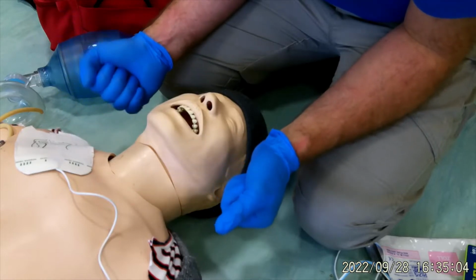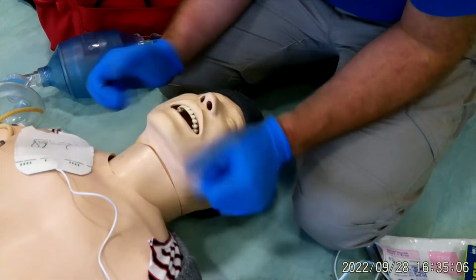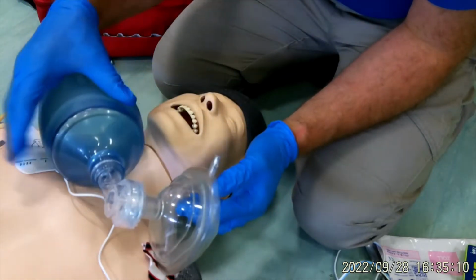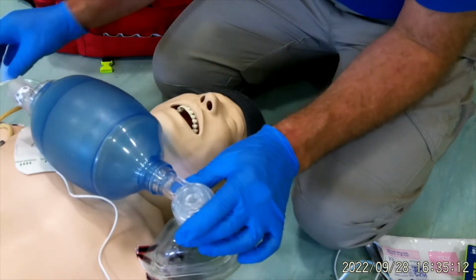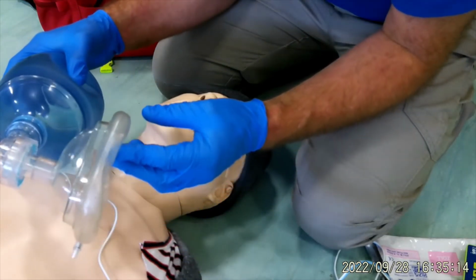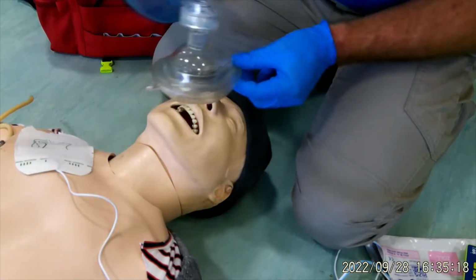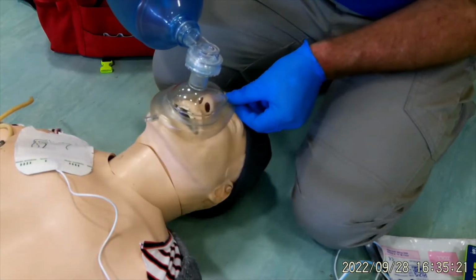Every 2 minutes we should change who's doing chest compressions. So because I'm on the airway, the first thing I'm going to do is look at using a bag valve and mask. So this would be attached to some oxygen. With the mask, we make sure the pointed bit is over the nose, and I like to put it over the nose first, then onto the chin.